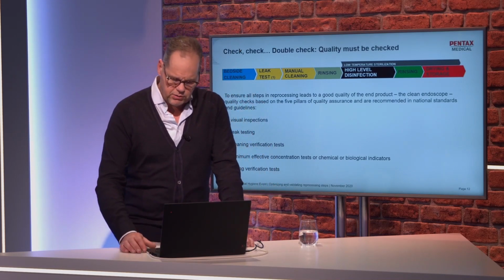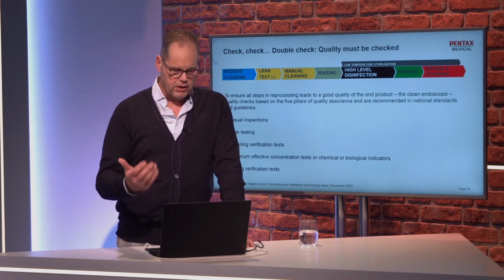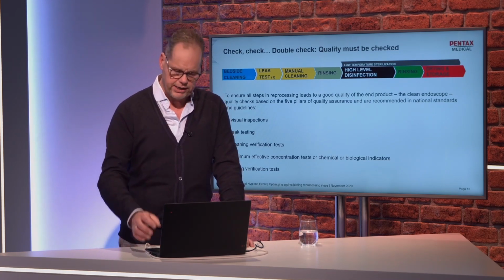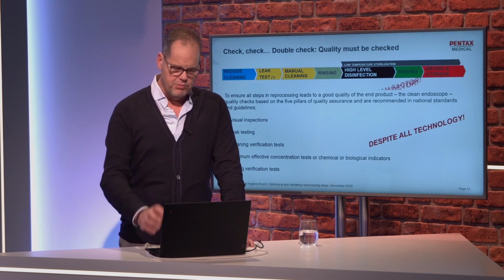But do we also have to address tests on the concentrations for the chemicals we are using? And also the drying verification test. Is this endoscope really dry after reprocessing and drying? We have to do it despite all the technology. It's still a human factor.